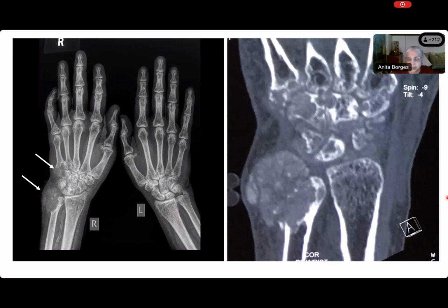Okay, very good. Now, Mansi, you were describing this lesion in the bone, right? You told me it was scalloped. Can you tell me what this scalloping is due to? Because you see that there is a fairly well circumscribed lesion. Is it in the bone, Mansi? It's not arising from the cartilage. It is actually in the soft tissue, and the soft tissue has eroded or scalloped the bone.